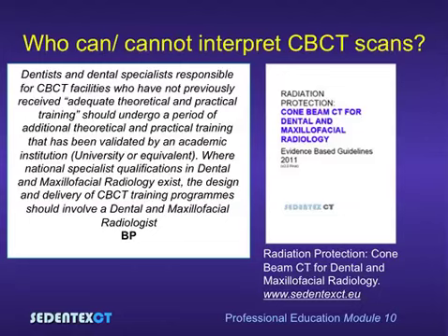A further recommendation is as follows. Dentists and dental specialists responsible for cone beam CT facilities who have not previously received adequate theoretical and practical training should undergo a period of additional training that has been validated by an academic institution. Where national specialist qualifications in dental and maxillofacial radiology exist, the design and delivery of cone beam CT training programs should involve a dental and maxillofacial radiologist.